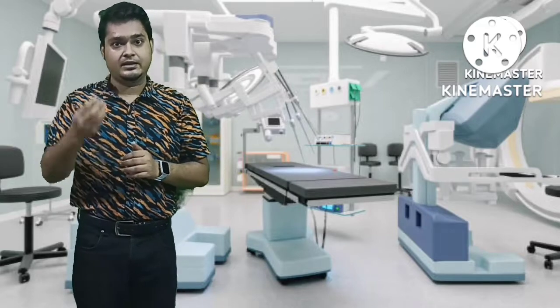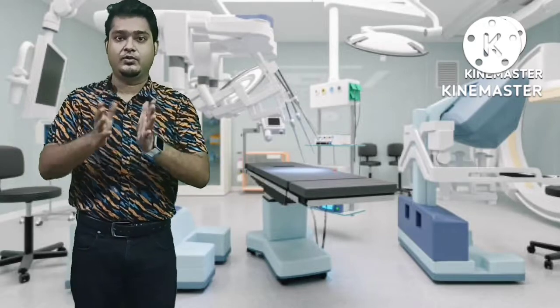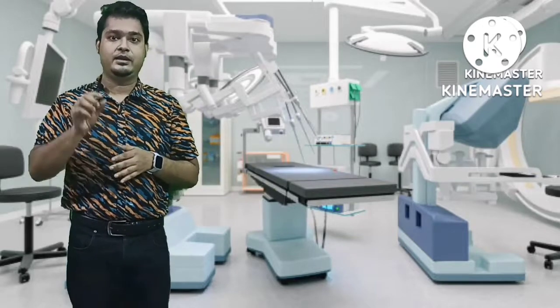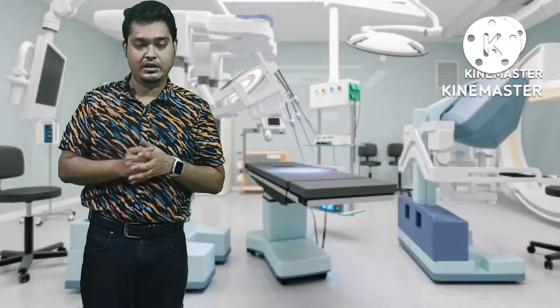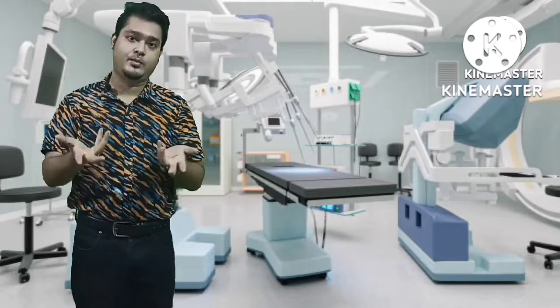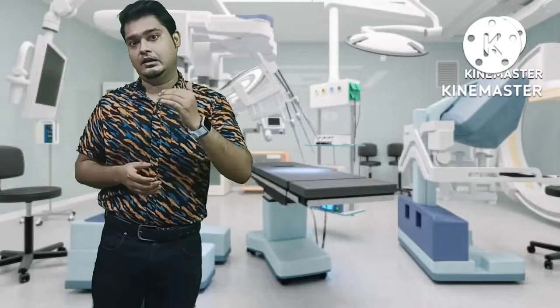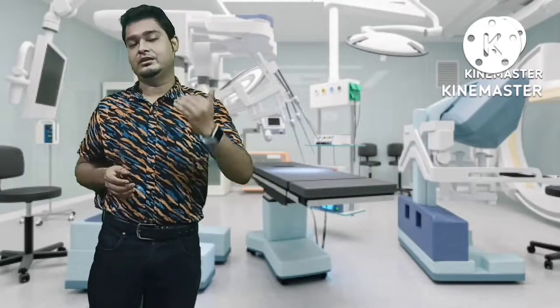Okay, so in that case we know that the patient is already having a blockage. So if we can perform the catheter angiography in the cath lab, then if we can see the defect, we can easily clear it. We can do a treatment with the help of a balloon or with the help of a stent.